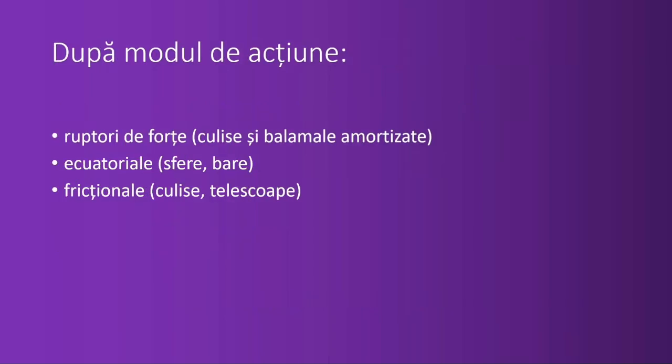Now, something has to be clarified: those systems are either force breakers, so the force is taken also by the mucosa, because the attachment has a spring that allows it to break the force.